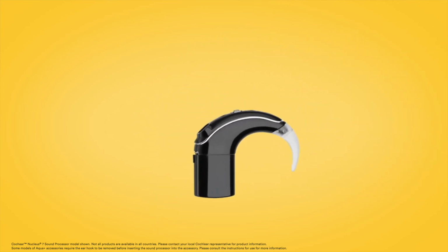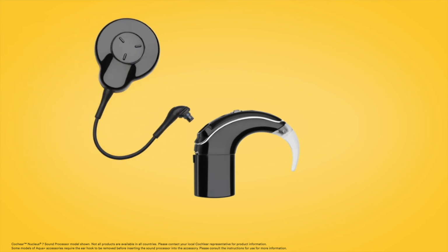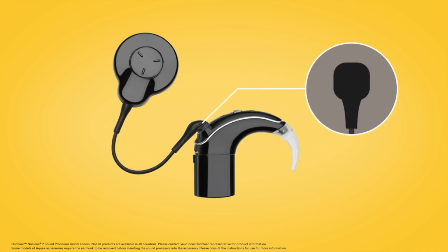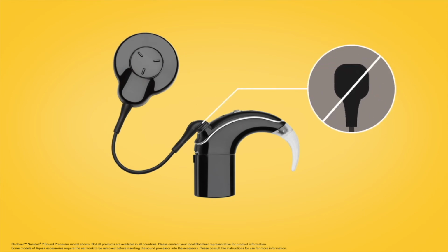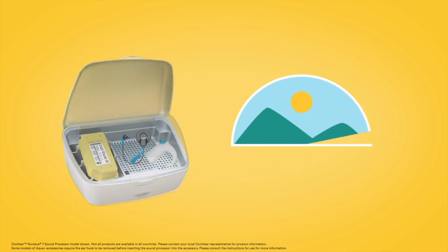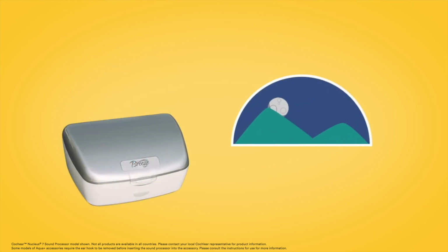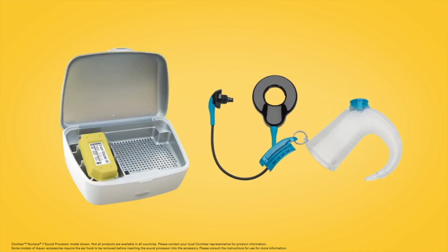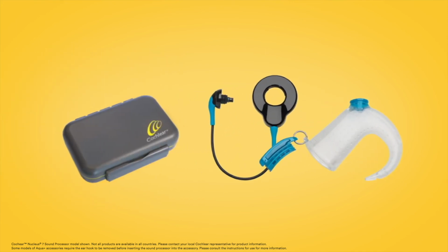You can now reattach your usual coil by pushing the coil cable into the sound processor until it clicks, being careful not to twist. You should place Aqua Plus and the blue Aqua Plus coil in your dry aid kit overnight. Then, once they're thoroughly dry, store your Aqua Plus system in the Nucleus 7 Activity Kit's waterproof case.